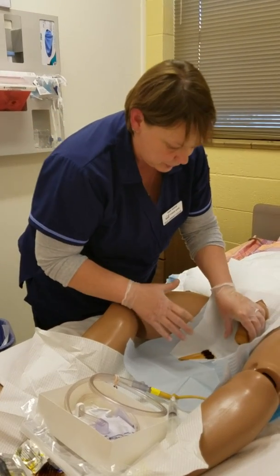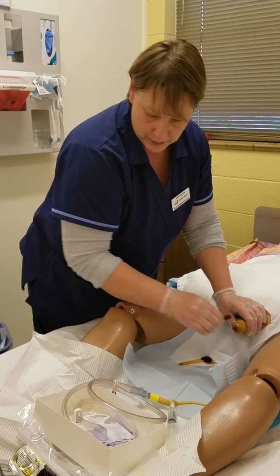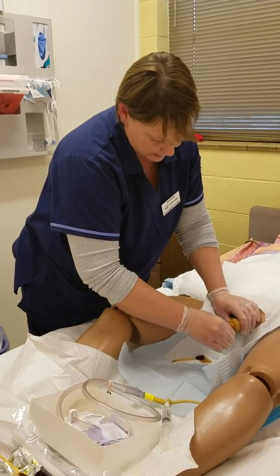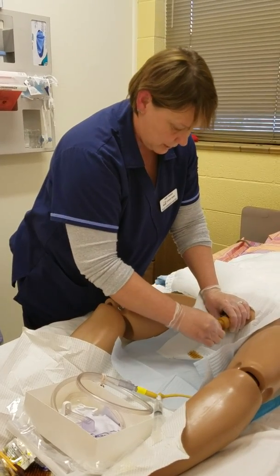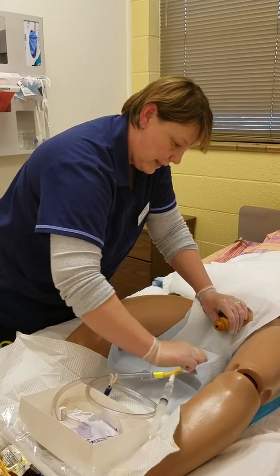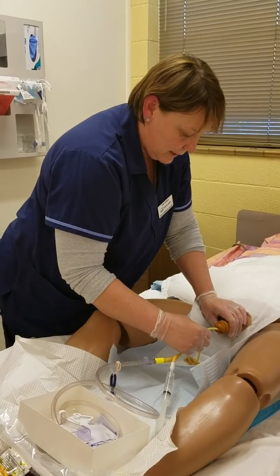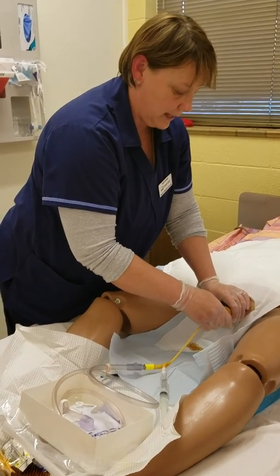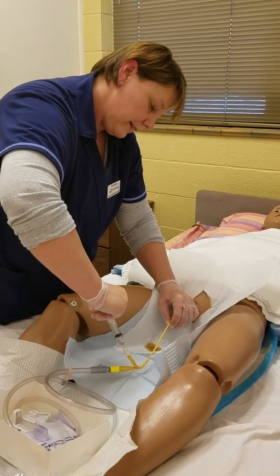Jose, you're going to feel me touching you just here for a moment. I'm going to take my betadine swab right around the urethra, then take the second swab starting at the urethra and going a little further around the glans, and then the third swab to make a slightly bigger clean area. Once that's done, I'll gather up my catheter. Okay Jose, I'm going to insert this catheter now — just relax and take a nice deep breath. I'm going to insert six to seven inches or until I see urine, then advance about an inch or two more.